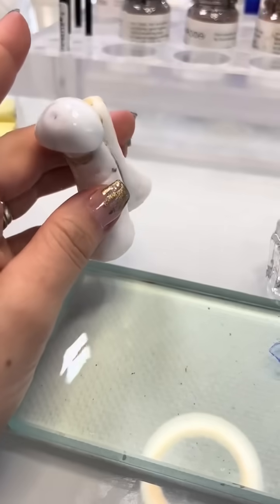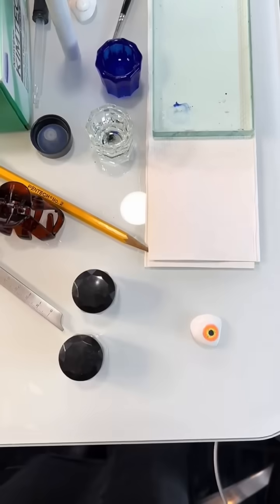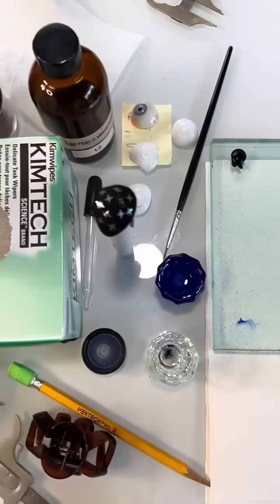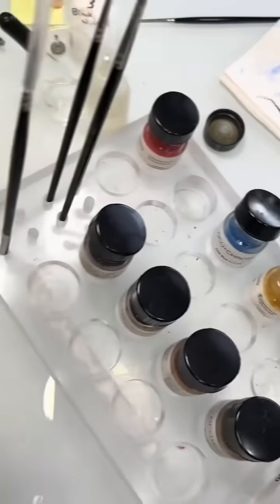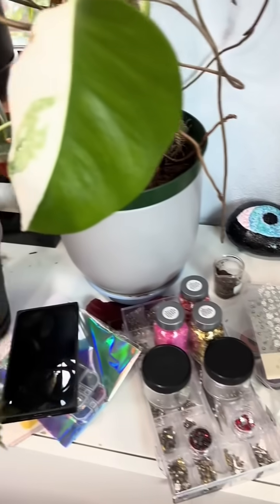Now one thing to keep in mind is that outside of painting the scleras blue, you do a wash afterwards of like an orangish reddish, which I'm not going to show you guys. Christina did that for me entirely to ensure that it looked pretty solid. So what we're going to move into now is painting my iris.